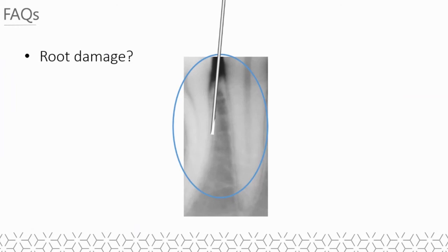If the patient starts feeling something, then simply stop the rotation by removing your foot from the orange pedal. Check the angulation of your needle. Is it too mesial or too distal? Remove the needle, change it if there have been over 3 or 4 rotations, reposition yourself with the correct angulation and start the rotation again.